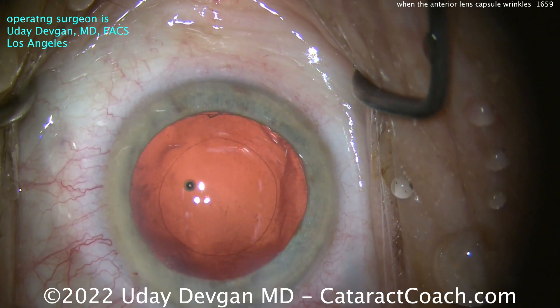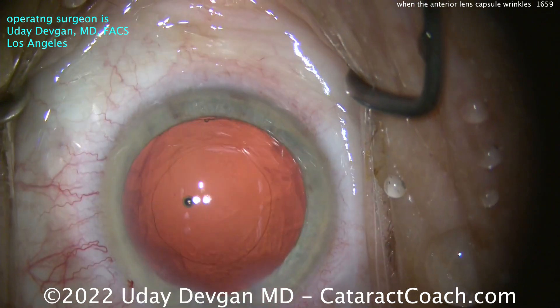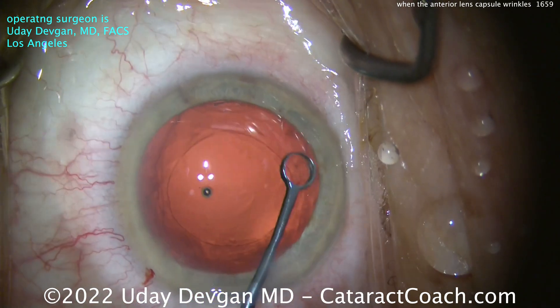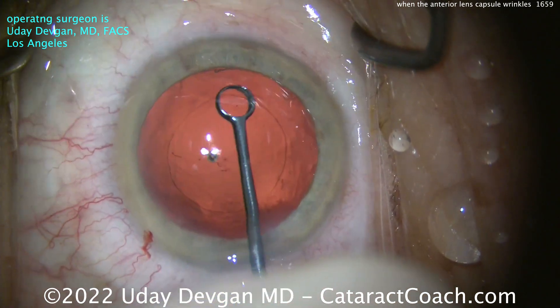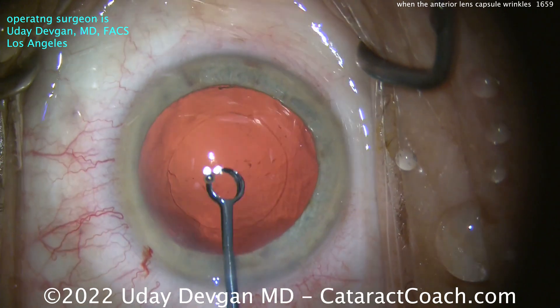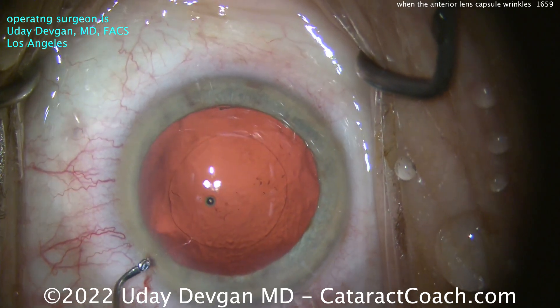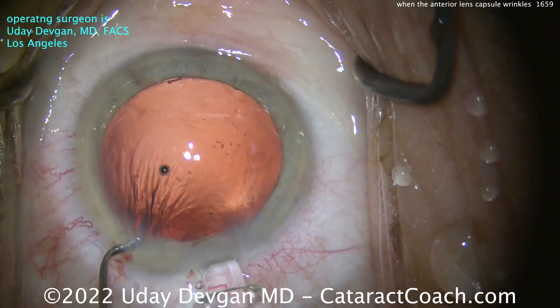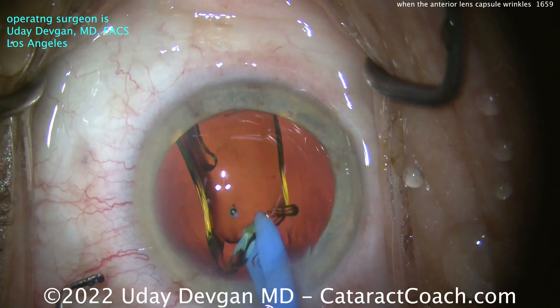It looks like a pretty reasonable rhexis — I'll take it. Cohesive viscoelastic fills up the capsule bag, and we do a little more capsule polishing to remove as much of those lens epithelial cells as we can. That's pretty clean. The IOL is going inside the eye — the power was 22 or somewhere in that ballpark, nothing out of the ordinary. Here comes the lens going in the capsule bag, and I don't suspect any more issues.